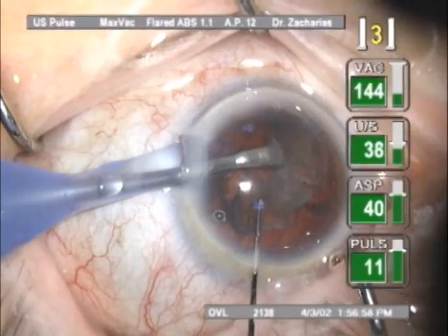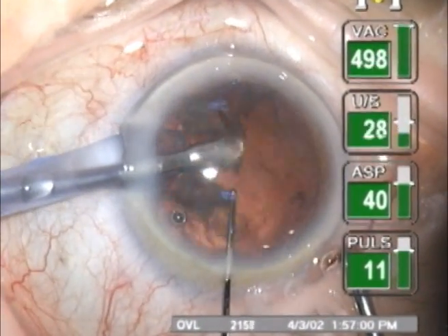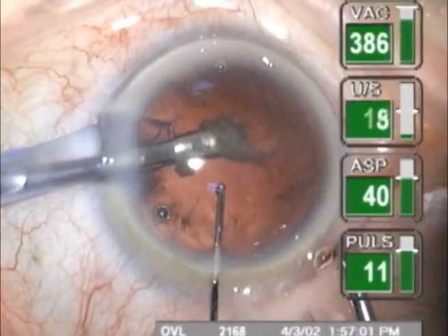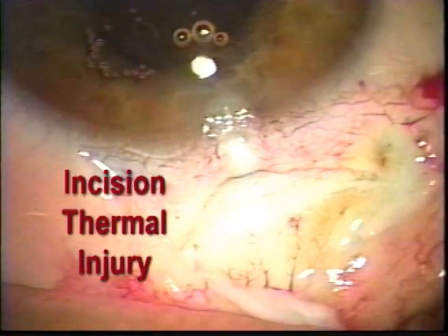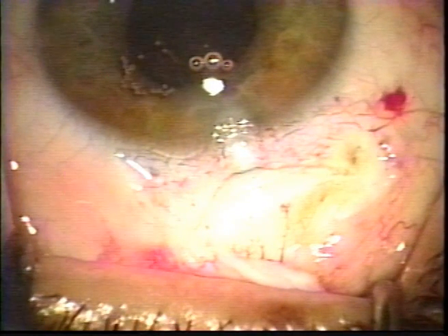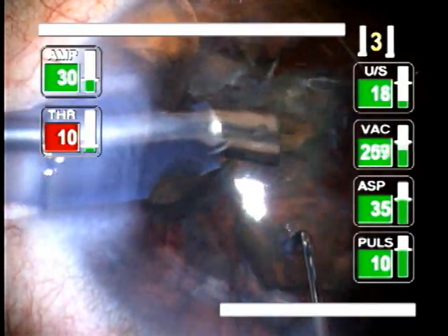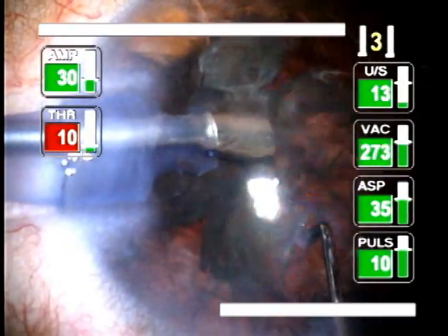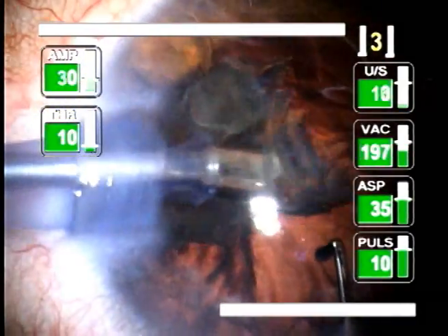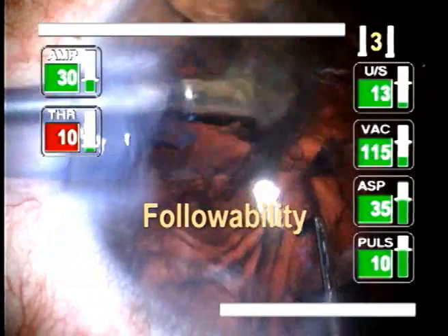Pulsed mode is useful to extract loose fragments of harder cataracts, as it reduces the risk of an incisional thermal injury because less total energy is delivered per unit time. Pulsed mode also enhances control in the aspiration of fragments and increases followability.